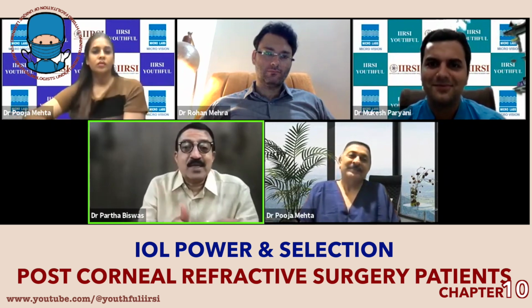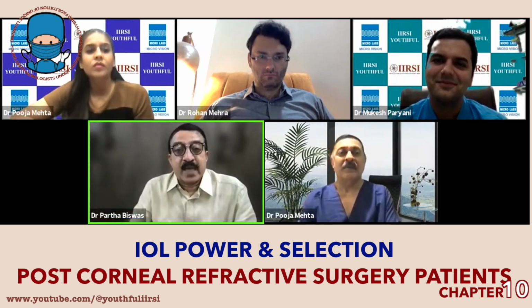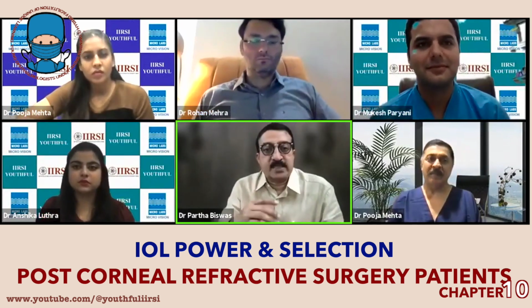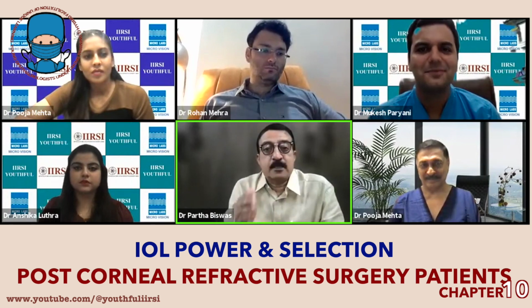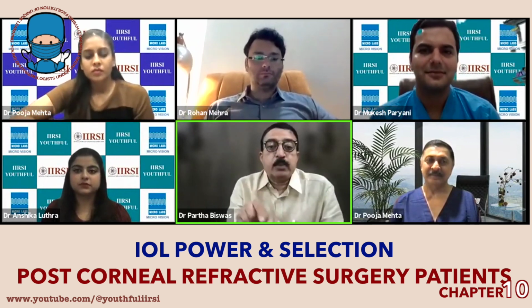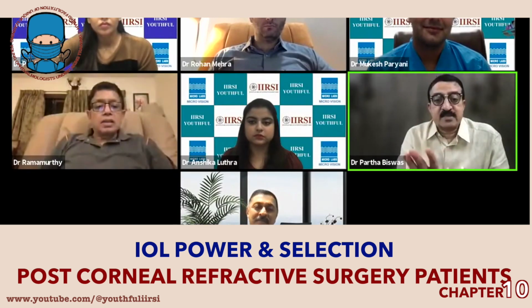And now with the newer formulas, I still carry on with this. Whenever there's a discrepancy between the formula and my optometrist's value, I still am on the side of my optometrist. And God willing, we have really proved that in quite a few cases, even the best of formulas that we are using now can land up with some amount of surprise. Not a very big deal, but some amount of surprise. So I still value the retinoscopy reflex. And after placing the lens, the optometrist checks once again whether it has been more or less neutralized. This becomes all the more important even with the RKs, where it is haywire. There's a huge cylinder, there is a poor reflex, but if it's a good optometrist, he'll be able to tell you that the surprise is not there.